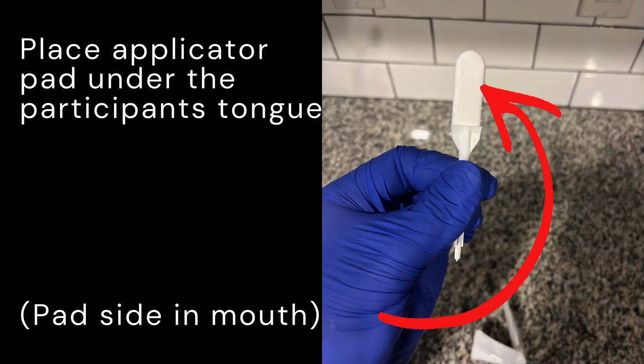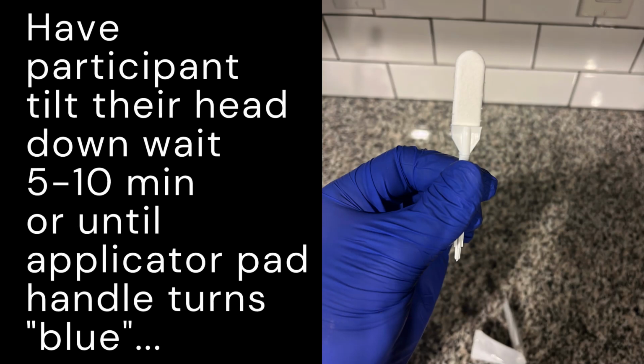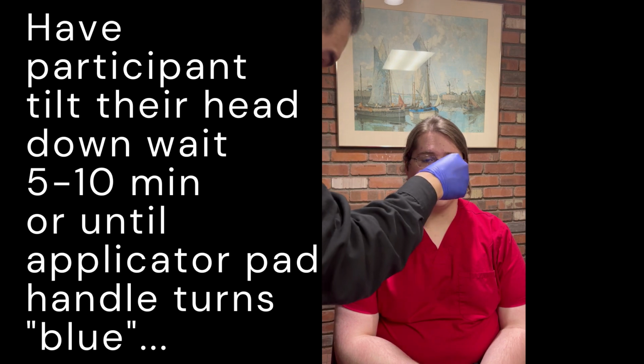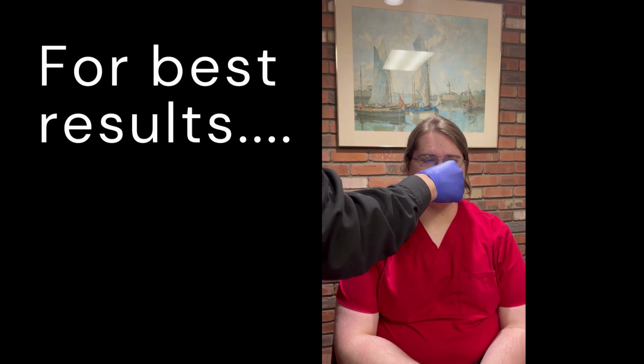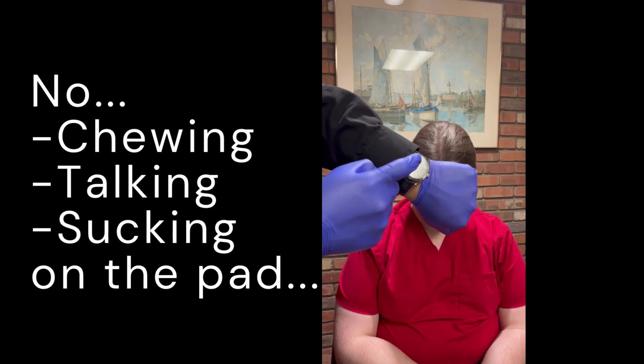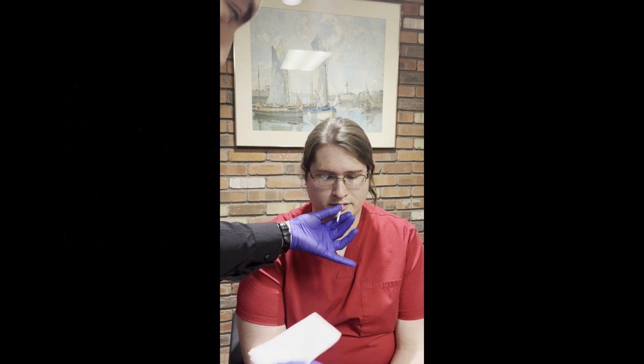Alright folks, it's specimen time. Place the applicator under the participant's tongue. Have your participant tilt their head down and wait 5 to 10 minutes or until the applicator pad handle turns blue. Just remind your participant that there is no chewing nor speaking while the pad is under their tongue.